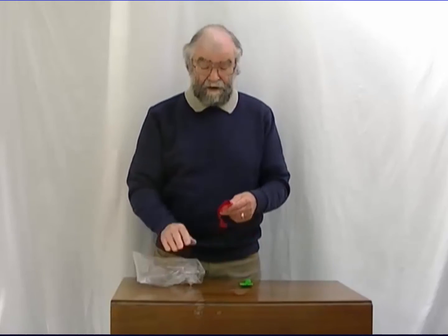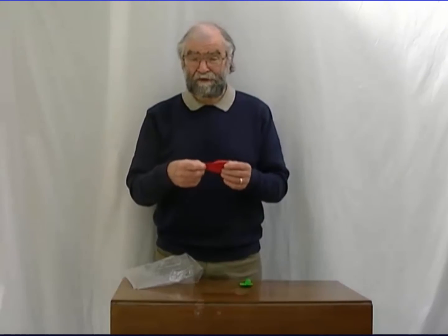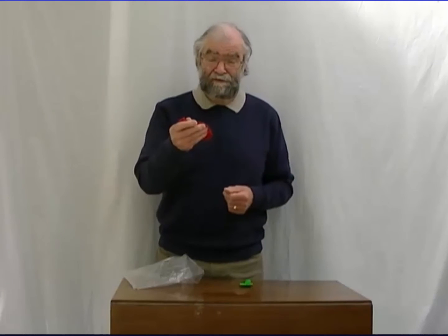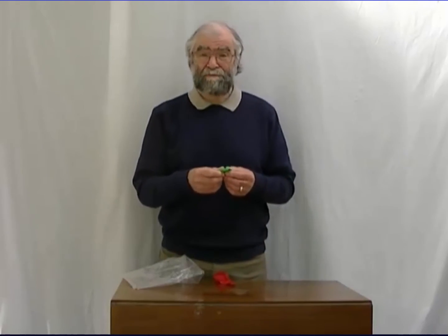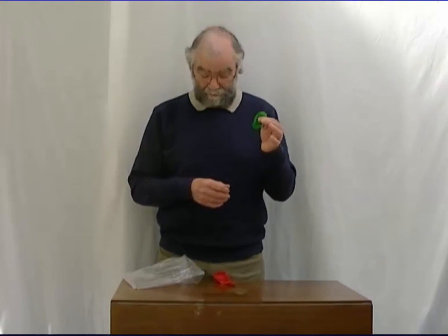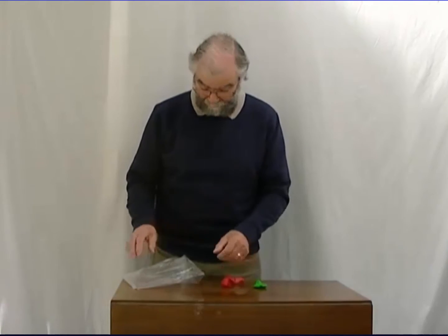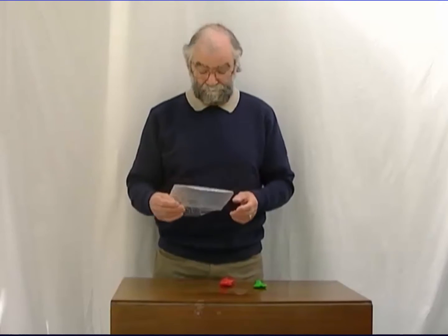This is a large volume obstructed system. It's characterized by a high pressure, and the pressure goes up even more with increased diuresis. And this represents a normal pelvis, which is a low pressure system. So the normal pelvis has small volume and low pressure. The obstructed one has a large volume and high pressure, and the hypotonic one has a large volume but low pressure. So that's how we can distinguish between the three systems.